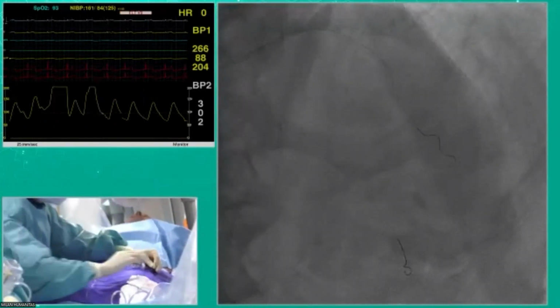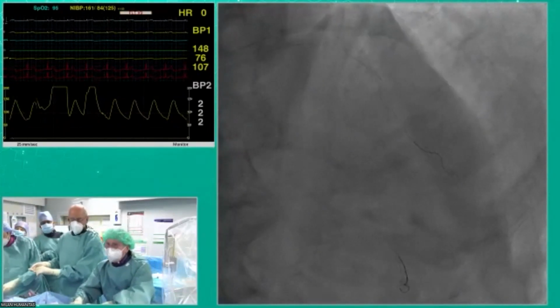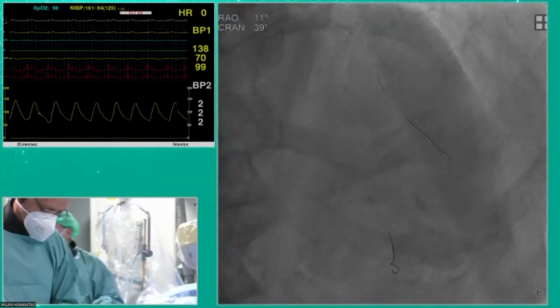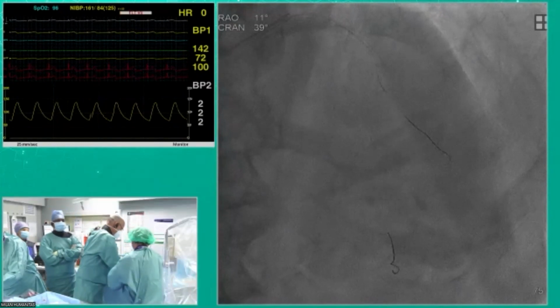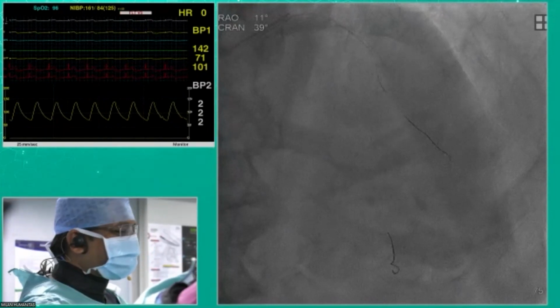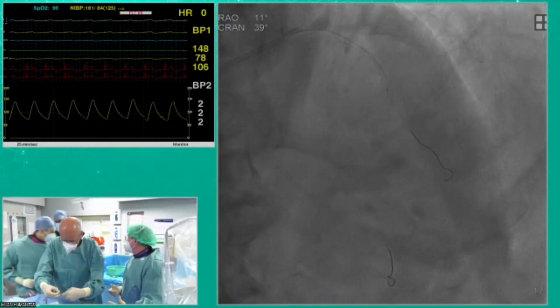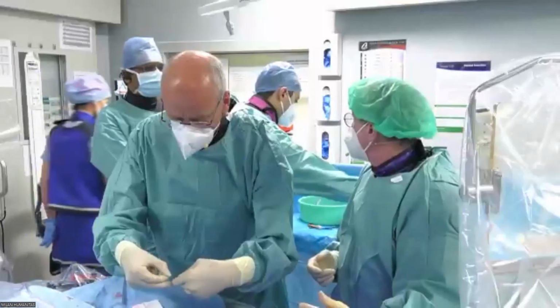Your opinion on drug-eluting scaffolds in the proximal lesion? If I had it, I would put in an 84-year-old gentleman, you may really wonder, but if you believe that people are born again, that may be okay. You're born again with a stent. Yeah. But I think in a short LAD, maybe the additional advantage is questionable. What do you think, Prem?